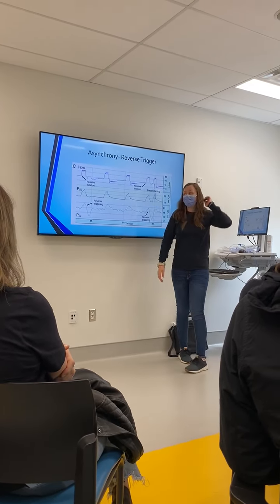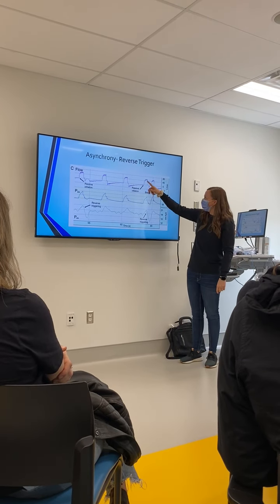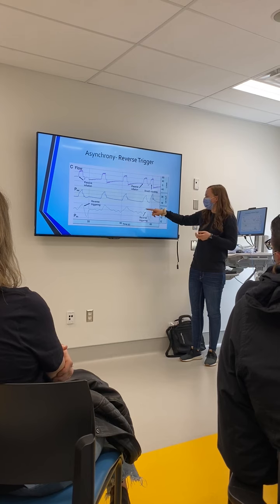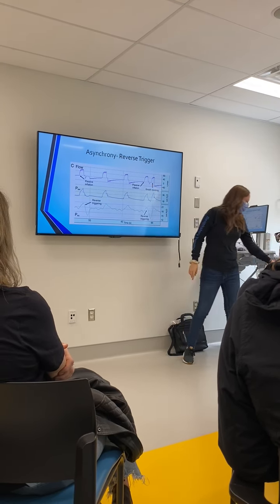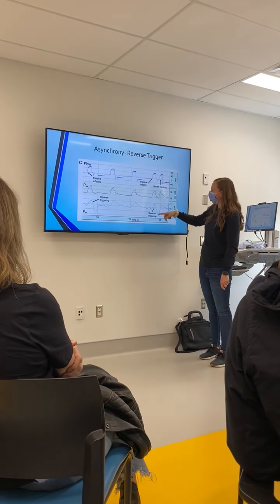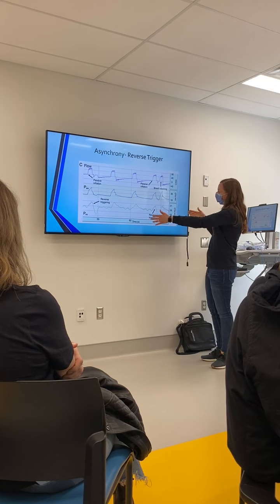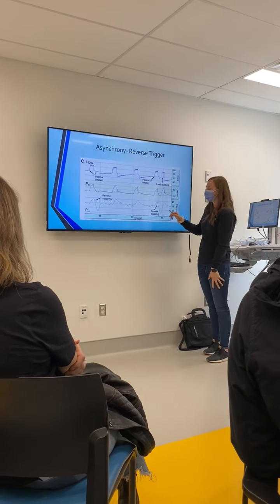And then lastly, they have breath stacking. The vent delivers the breath, the pressure goes up in the esophageal pressure, but then the patient gets stimulated and wants to breathe. So they take a breath, and that's what causes the next breath to go in. You can see when a breath stack happens what is actually going on. Well, it's the patient breathing in this case. It's not just an auto trigger or an extended breath. It's them triggering in the middle of the last breath.